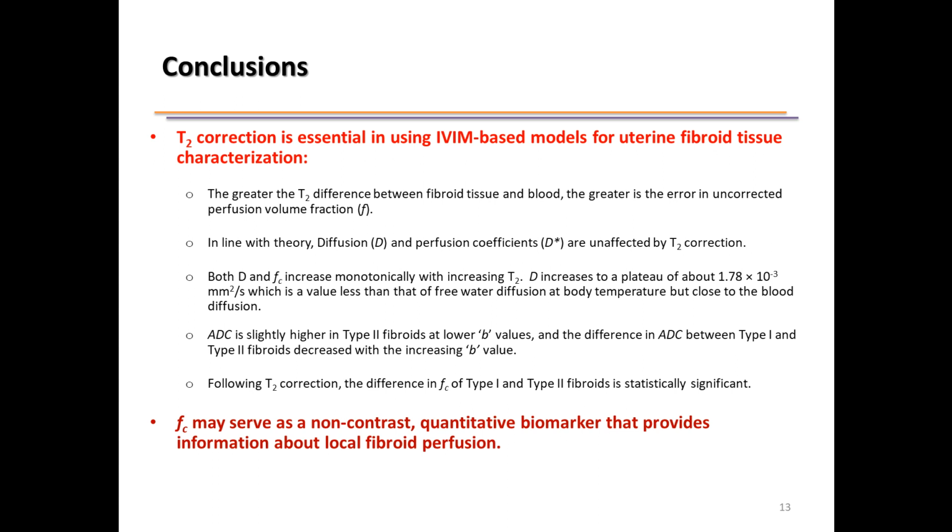In conclusion, in this study, we proved that T2 correction is essential in using IVIM-based models for uterine fibroid tissue characterization, and T2 corrected blood volume fraction may serve as a non-contrast quantitative biomarker that provides information about local fibroid perfusion.